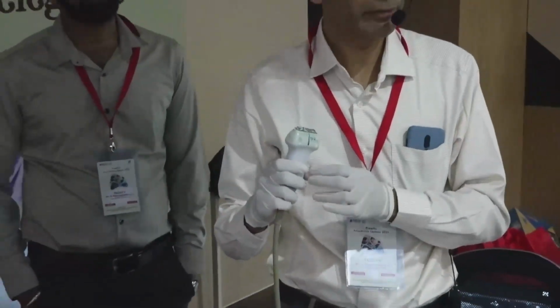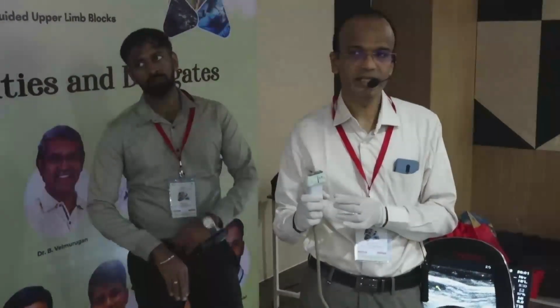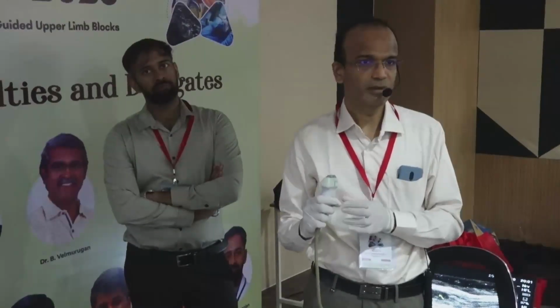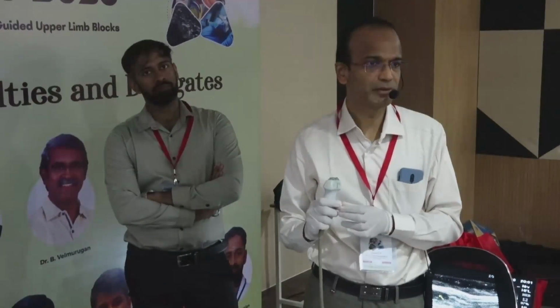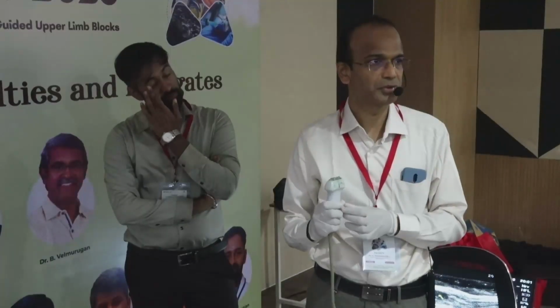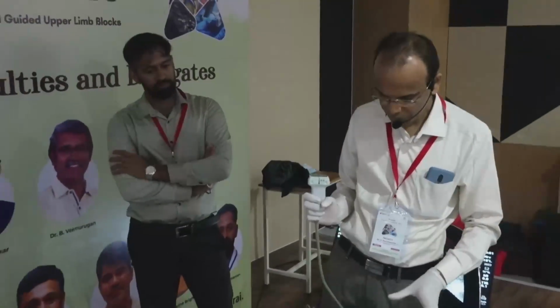And scout scanning we have to do with either the linear probe first. Obviously, if you face difficulty in obese patients or muscular patients, better to choose the curve linear probe, and you have to reorient ourselves, then give the block. Especially for costoclavicular and infraclavicular, we have to use the curve linear probe. So next, I will move on to the position of the patient.